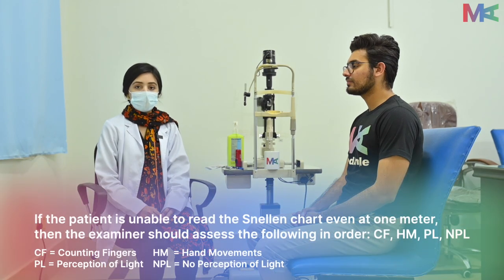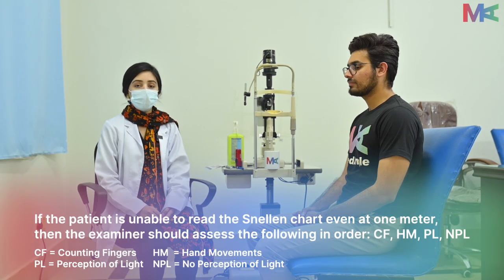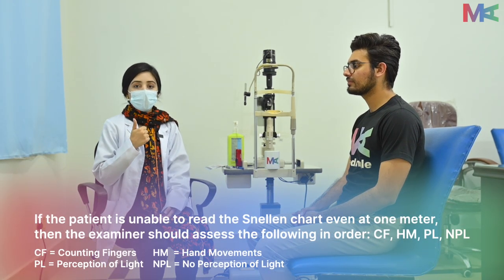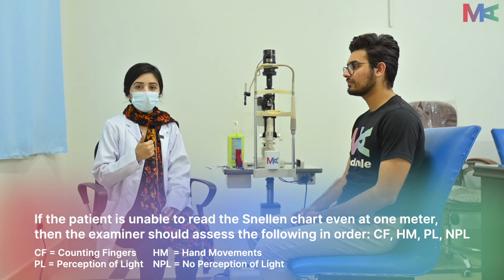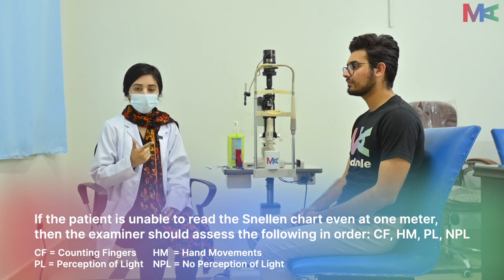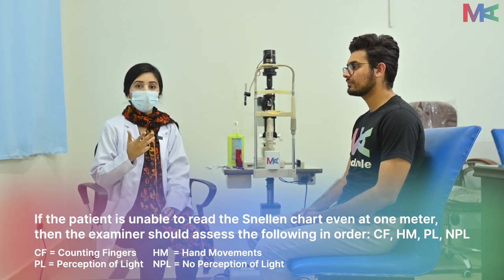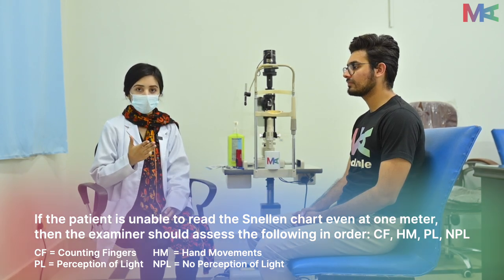The visual acuity assessment needs to be continued further. Is mein hum madad ke liye chaar cheezein dekhenge: finger counting, hand movement, perception to light, or no perception to light.